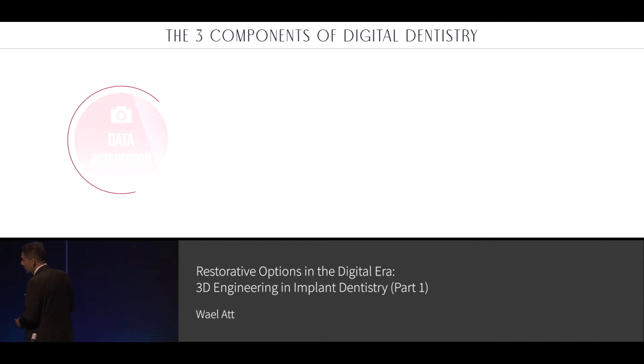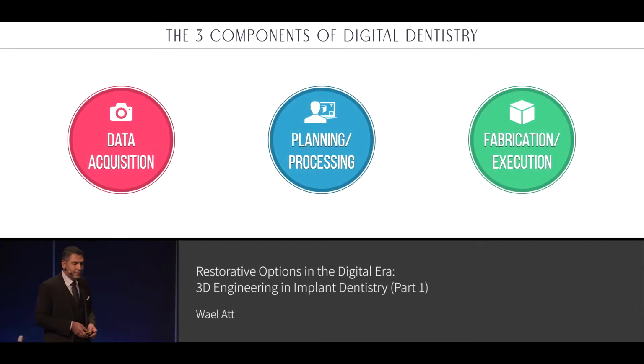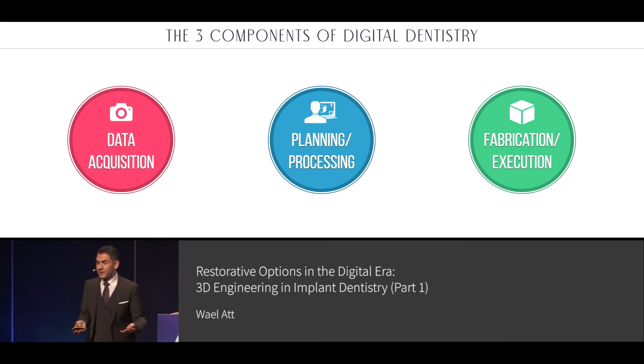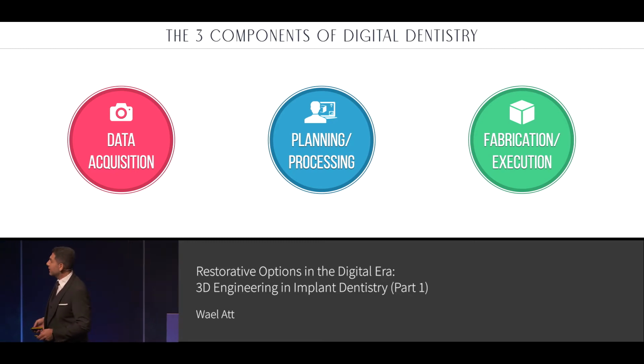But first of all, we need to have a common understanding of what digital dentistry is. You sit with colleagues or have a chat with other dentists, and they tell you, I'm doing CAD-CAM. They say, I'm doing digital because I'm doing CAD-CAM. But CAD-CAM is just one small portion of the whole digital workflow. Once we discuss the digital workflow, it's composed of 3 components.